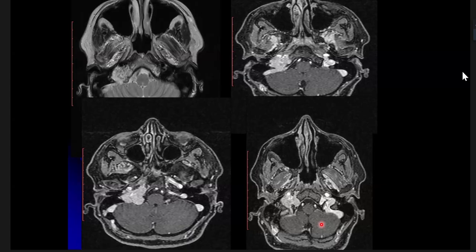Sir, schwannoma is one of the DD. Excellent. Another DD? Meningioma in that. Jugular meningioma. And so much vascularity with destruction. What is your first thing if patient is more than 40 years? Metastasis. Excellent. So heterogeneously enhancing lesions in jugular foramina, most common being paraganglioma, other being meningioma, third being schwannoma, and fourth can be hypervascular metastasis.